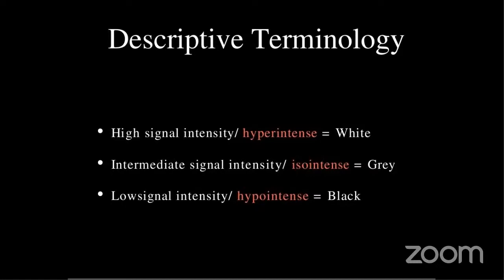At least you should be able to tell the basic pathologies that you see in your day-to-day practice. And if you see something, you should know what extra sequence you have to put in if you do not have anybody around to tell you, because shifting the patient back and forth is a cumbersome job. So you should be able to assess, to the very minimal extent at least, what more you might want to do with this, right?